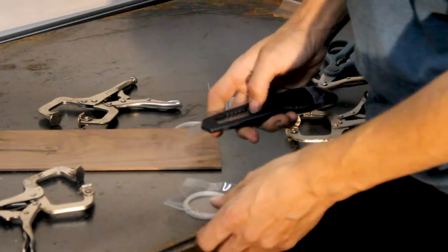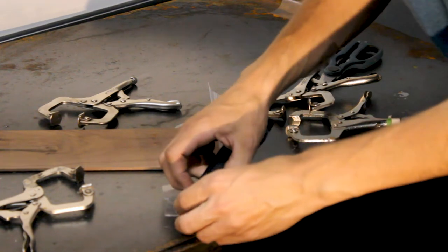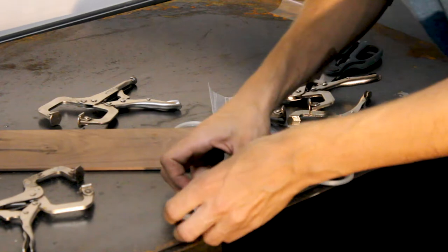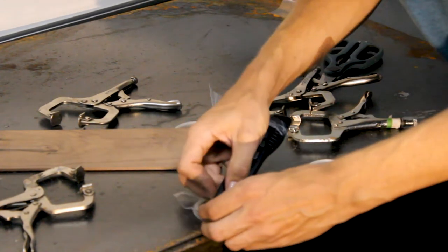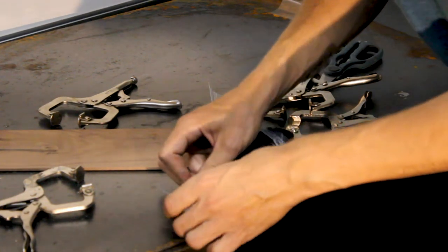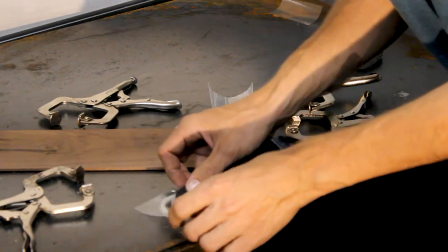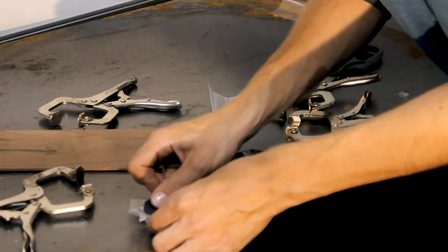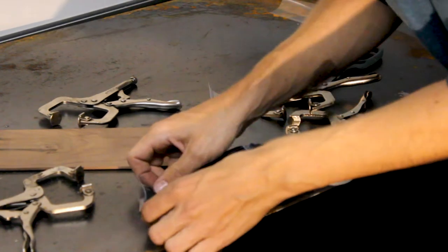And then I'm gonna take a razor and cut this off, but I'm gonna try not to pull on the silicone too hard, otherwise it'll pull it out of the gasket and then it'll lose its seal. So I'm just kind of pressing the knife against the edge of the plastic. And it is cutting pretty flush with that edge.